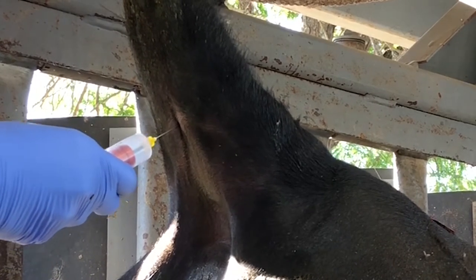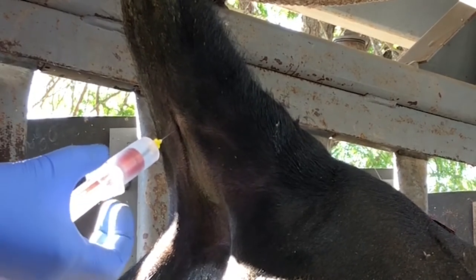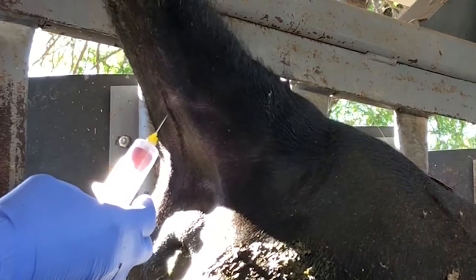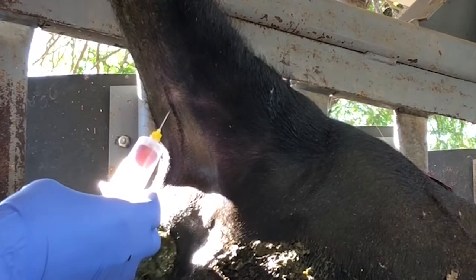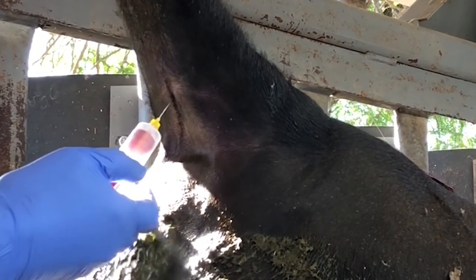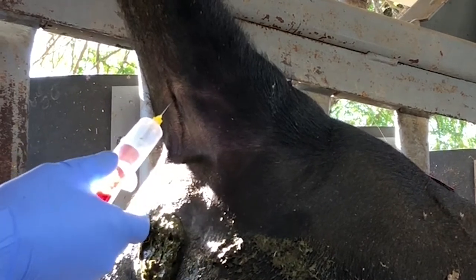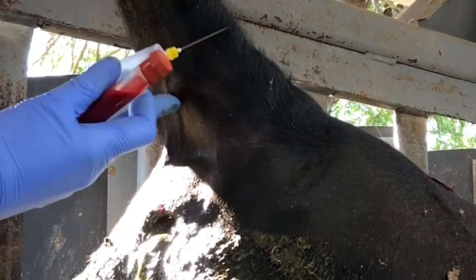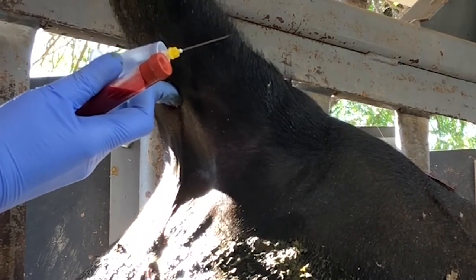You push the needle in as far as it goes and then push the blood tube on. If you don't get blood flow right away, you should make sure the tube is attached correctly. You can roll the needle or redirect the needle. However, when you redirect, make sure you detach the blood tube first to avoid losing the vacuum, and then when you're done apply some pressure to avoid a hematoma.